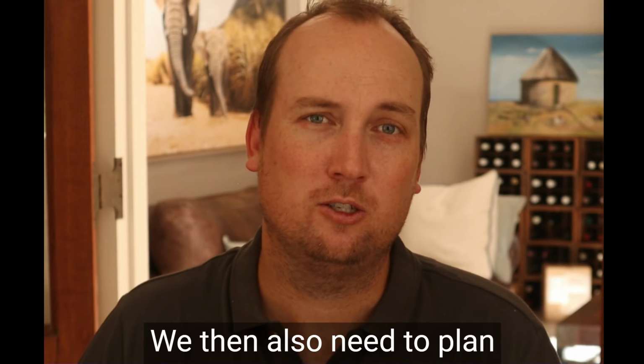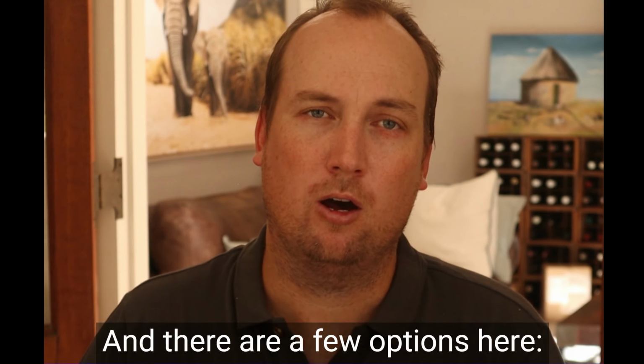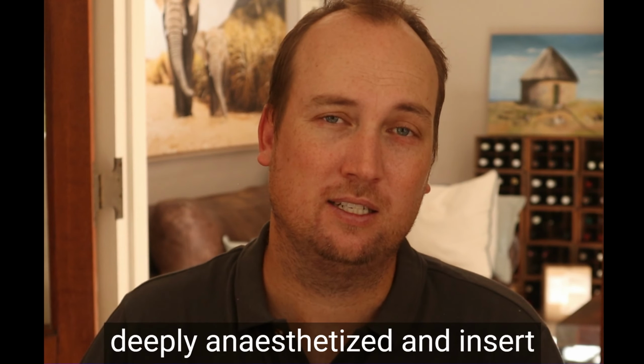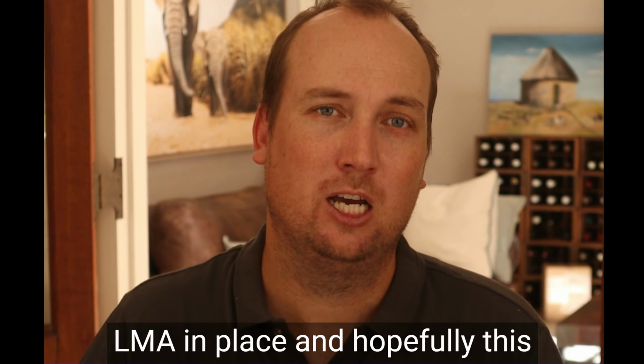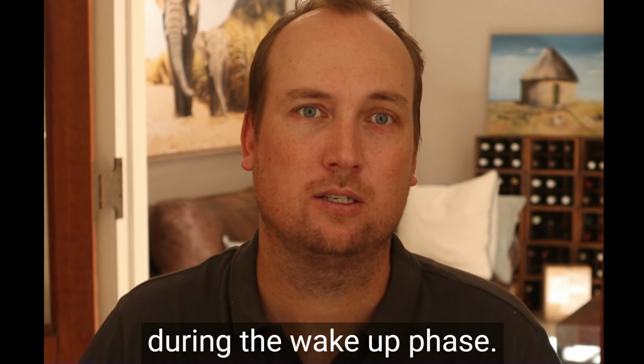We then also need to plan for a high-risk extubation. And there are a few options here. We could extubate the patient deeply anesthetized and insert a laryngeal mask airway and then wake the patient up with the LMA in place. And hopefully this would cause less airway irritation during the wake-up phase.